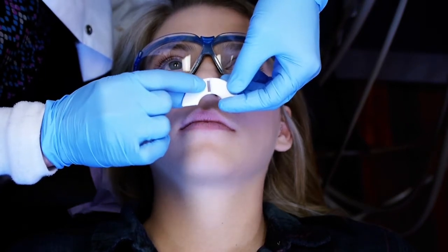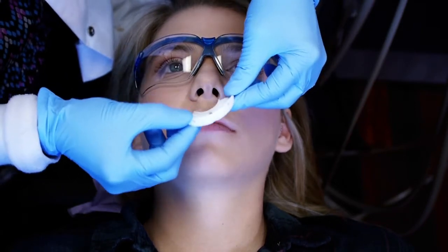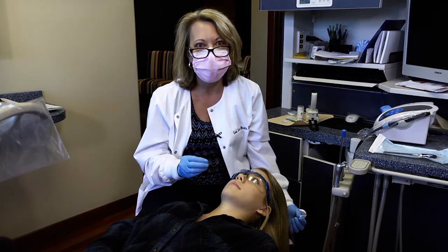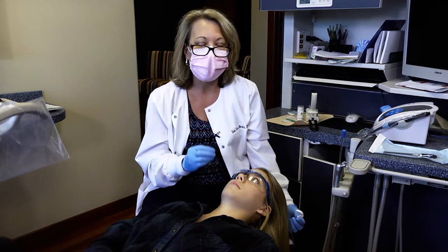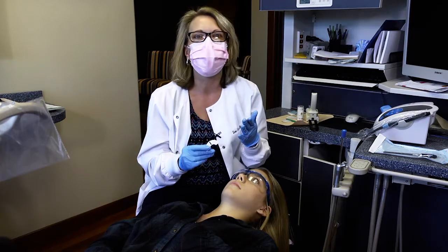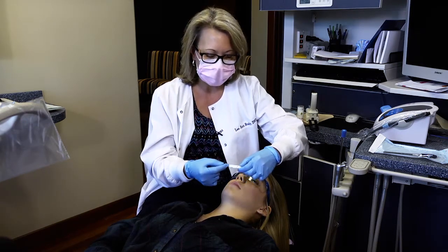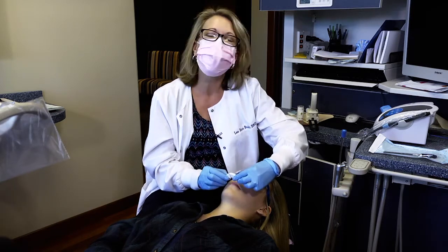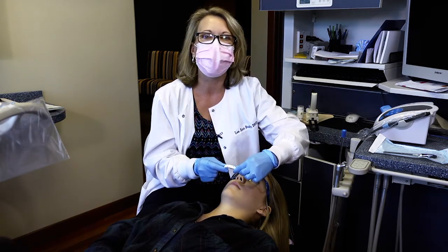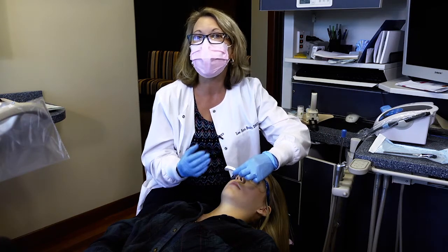It also has a slit in the anterior right at the midline, designed for retention of the material. I'm trying it in for two reasons: first, I want Jenna to experience having it in her mouth and biting against it, so that when we do that with bite registration material in it, she's familiar with what I'm going to ask her to do. I'm also visually getting a reference for positioning it over her teeth, wanting that slit at her midline.